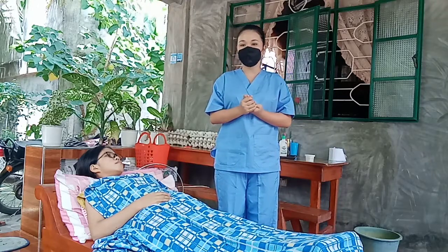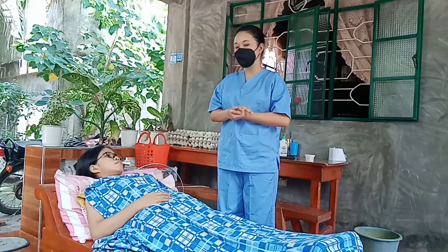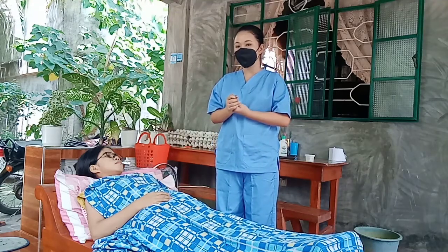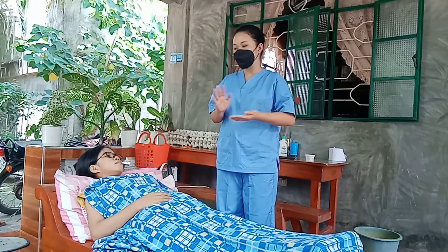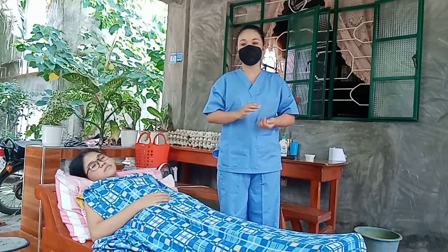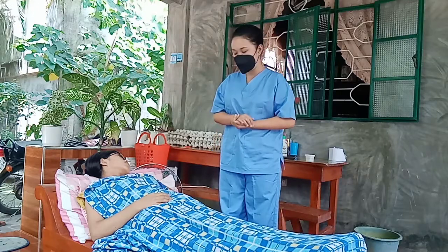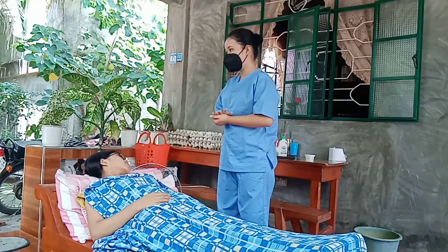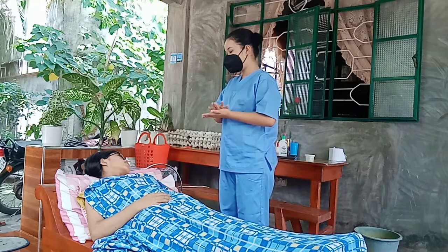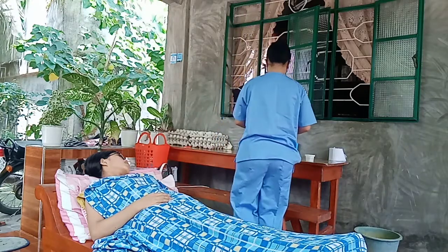So next is explain that the catheter needs to be clamped from 10 to 15 minutes before obtaining a specimen and that it would not be obtained from the drainage bag. So, I will clamp your catheter, ma'am, for 10 to 15 minutes.